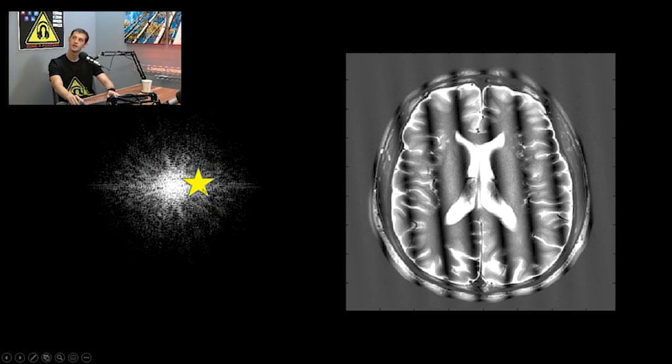And because it is fairly close to the center, it has this slower frequency, versus if I shift it out to the right, now it's higher frequency. What pattern do you think you'll see? Darker? Higher frequency? Robert says darker. I'm going to say it's going to be the same, but the lines are going to be different.